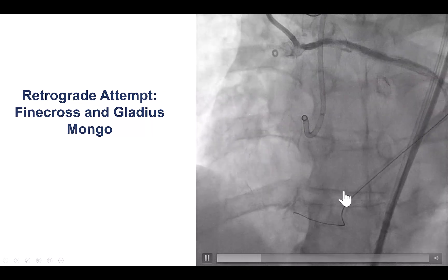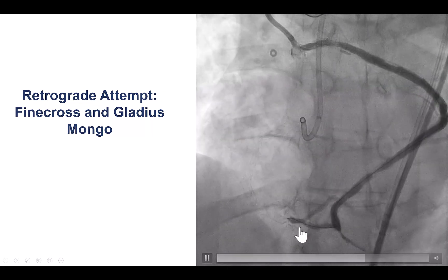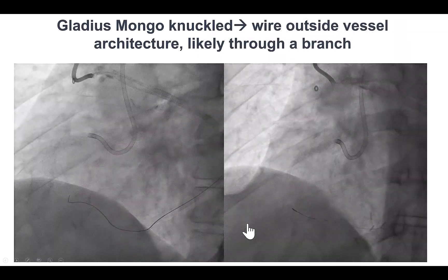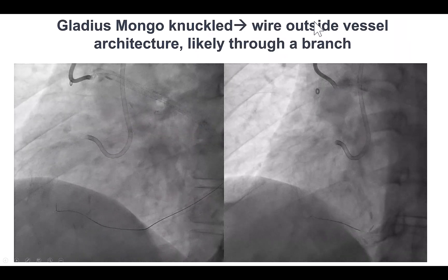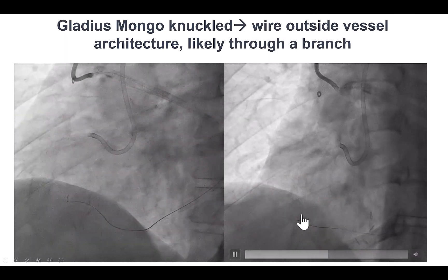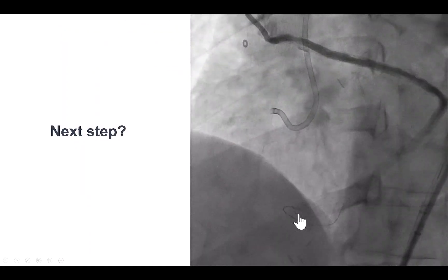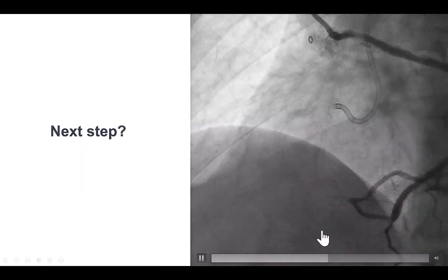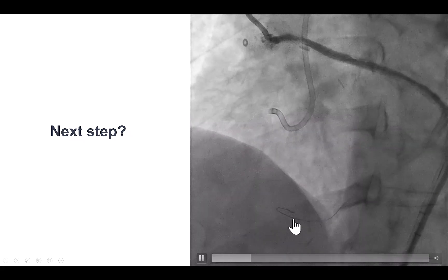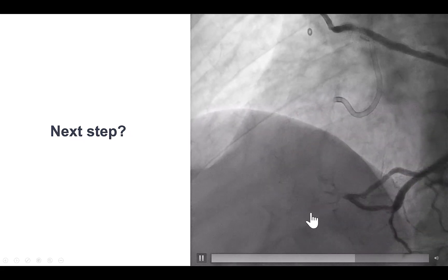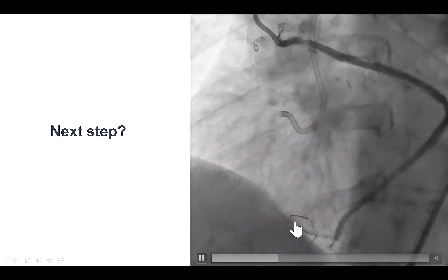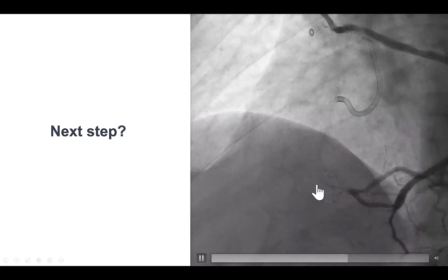We inserted a Finecross and a Gladius Mongo retrograde, and then tried to knuckle in an attempt to cross the occlusion retrograde. However, the knuckle seemed to not move along the course of the vessel. Once we performed an injection, we observed a coronary perforation in the distal RCA — we had likely entered into a small branch of the distal RCA, causing the perforation.